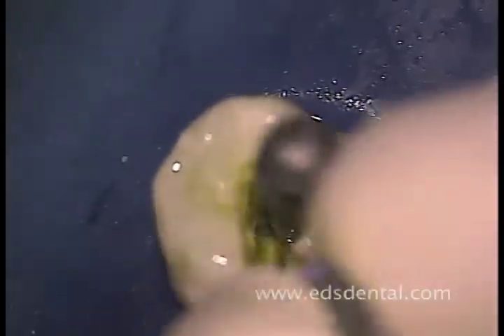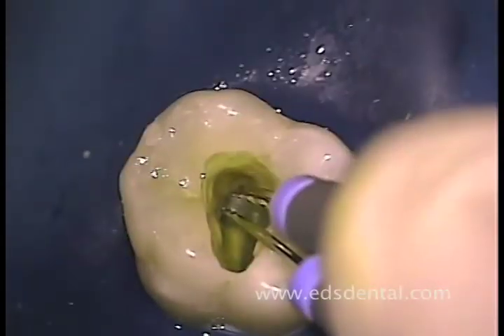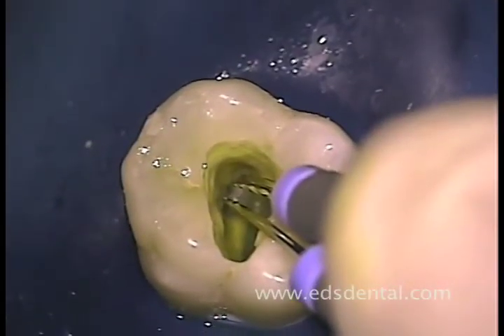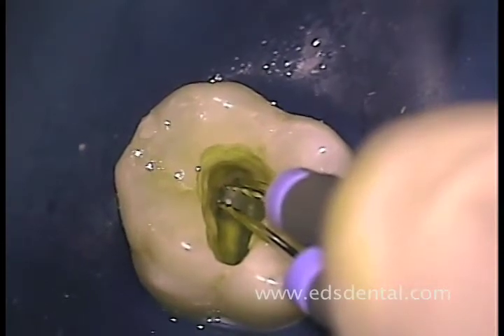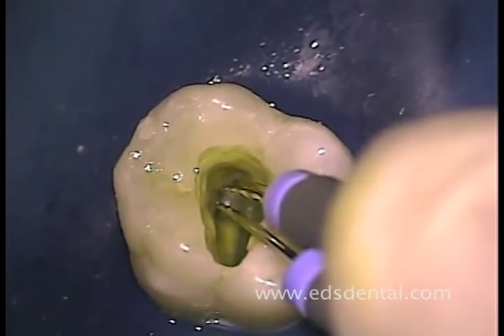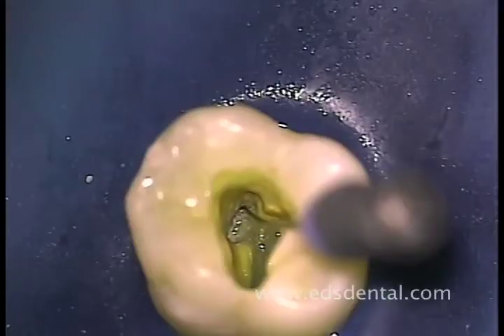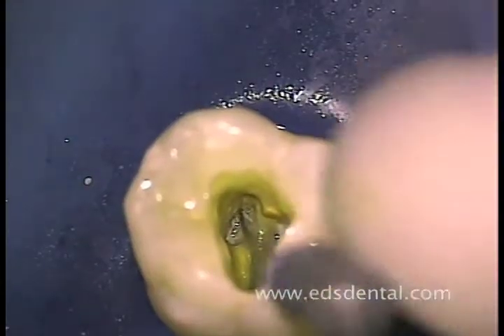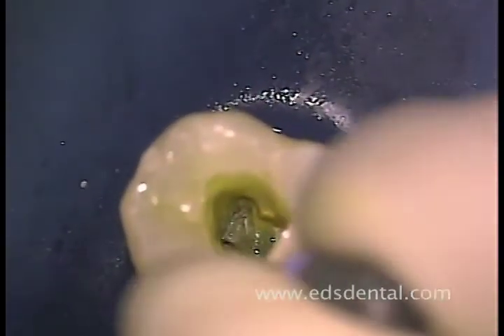As you can see, the groove uncovered with the Munce burs provides space for the placement of 3 reamers. We have not determined yet whether or not these are 3 independent canals or rather a long, thin, oval sheet of tissue that is simply providing for 3 openings to place the instruments. You can distinctly see the 08 reamer entering each of the 3 openings in the mesial buccal portion of the pulp chamber.